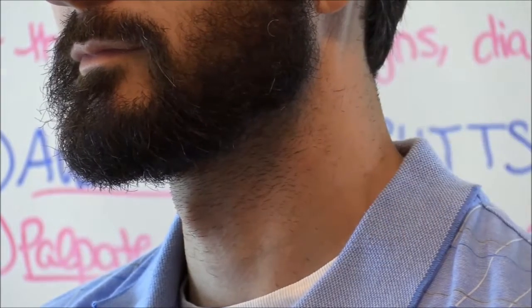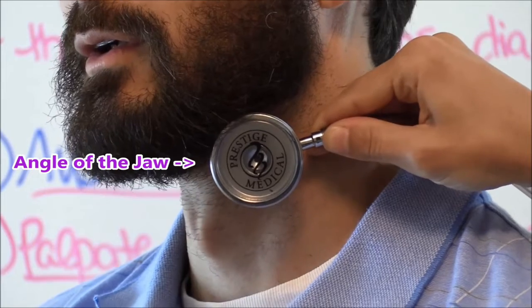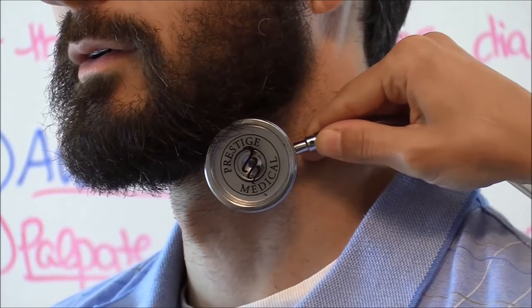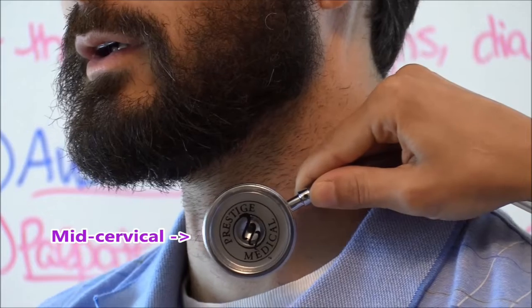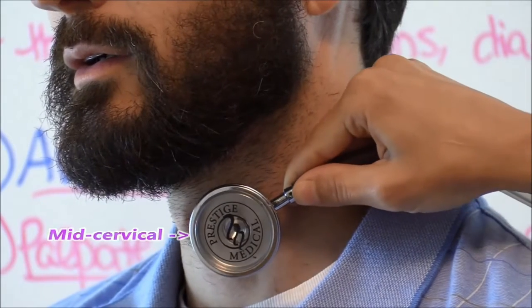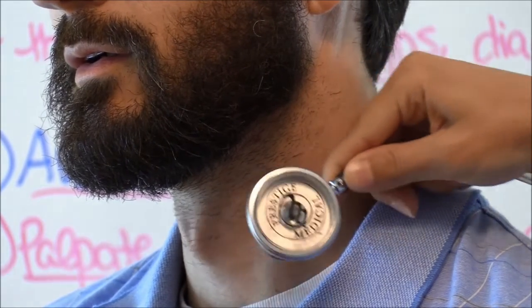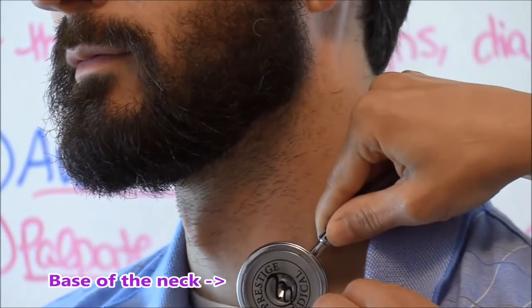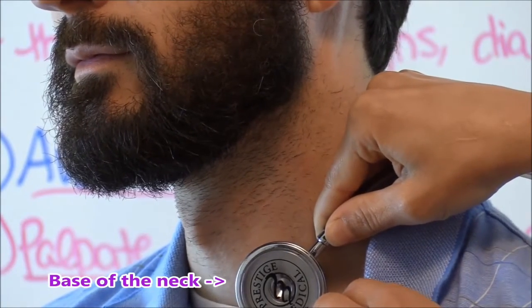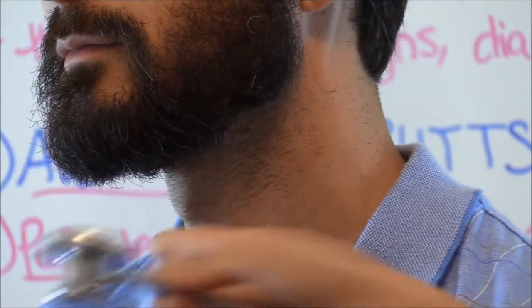So we're going to listen real fast. Take a breath for me and exhale. Okay, take a breath for me and exhale again. Okay, again. Okay, and that sounded great. And then you're just going to compare sides and repeat on the other side.